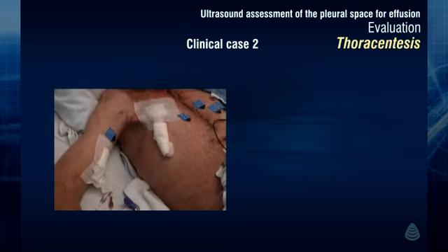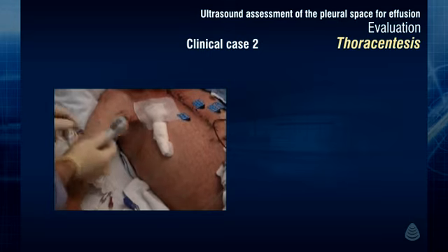A bedside ultrasound was performed to evaluate the right lung to see if the opacity represented mostly collapsed lung or a significant pleural effusion. As the patient had respiratory insufficiency, findings of a significant pleural effusion would motivate its drainage, while findings of significant atelectasis would motivate a bronchoscopy and potential antibiotic treatment.